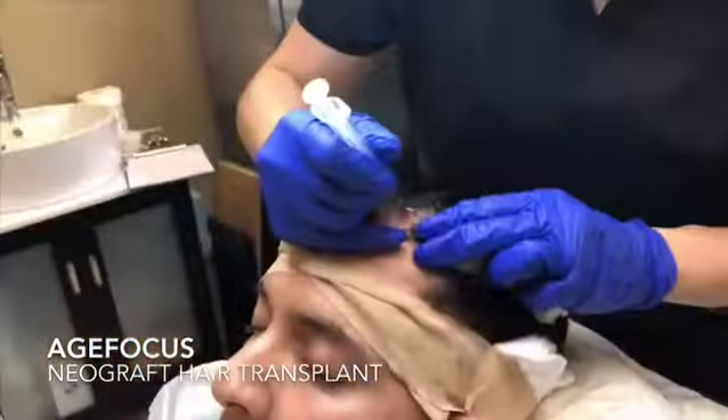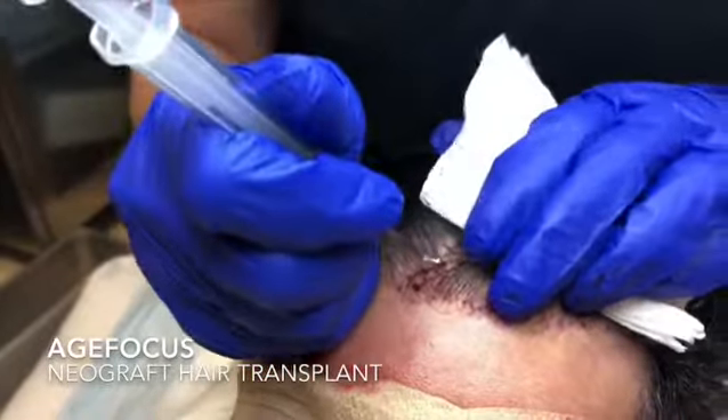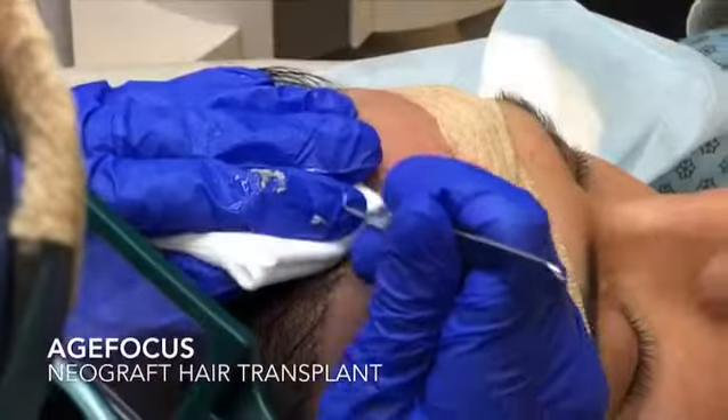Recipient sites are punctured into the desired areas of the scalp at proper depth and angulation to ensure the graft's new home will have the best possible take rate and growth opportunity.